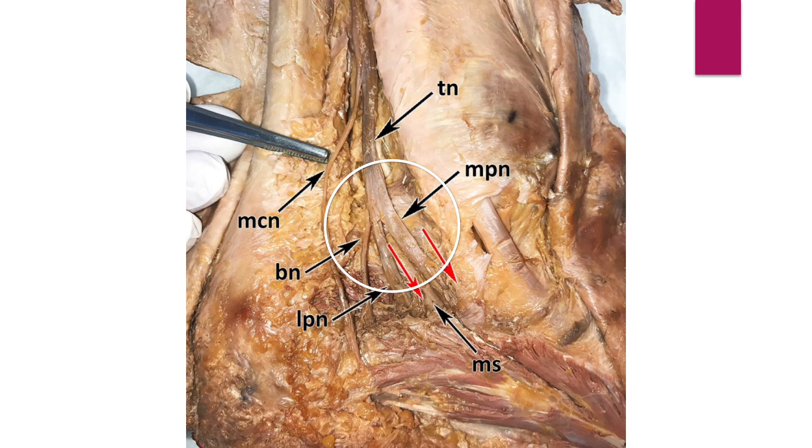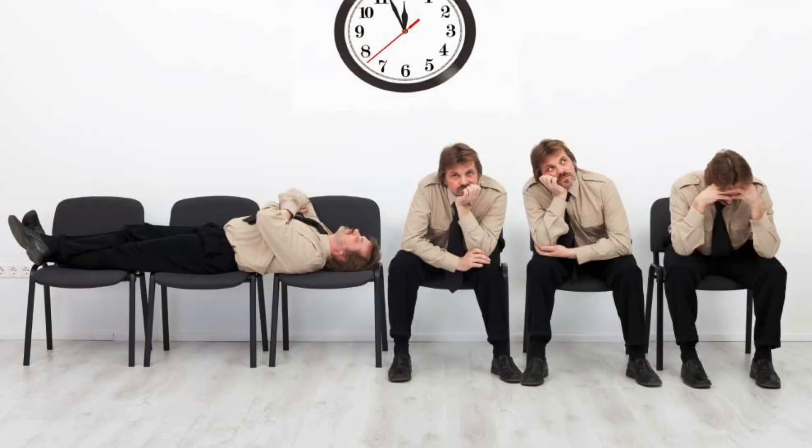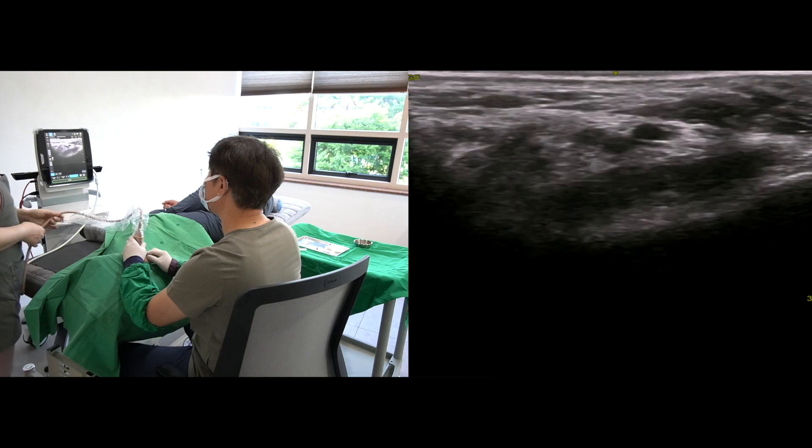The distal nerve consists of multiple smaller branches. I prefer to save time by selecting the smaller branches, so I always try to select the target distally.